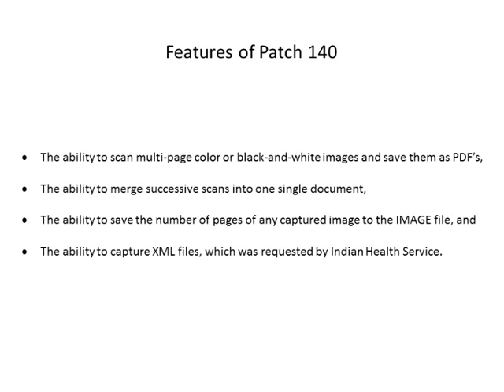privileges. The enhancements to clinical capture included in Patch 140 are the ability to scan multi-page color or black and white images and save them as PDFs, the ability to merge successive scans into one single document, the ability to save the number of pages of any captured image to the image file, and the ability to capture XML files, which was requested by Indian Health Service.